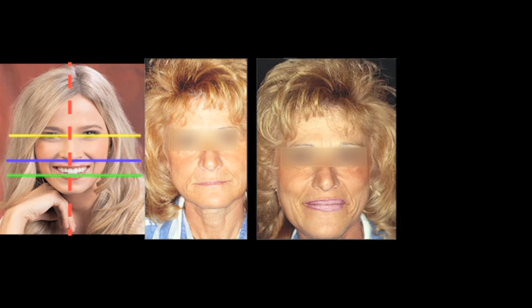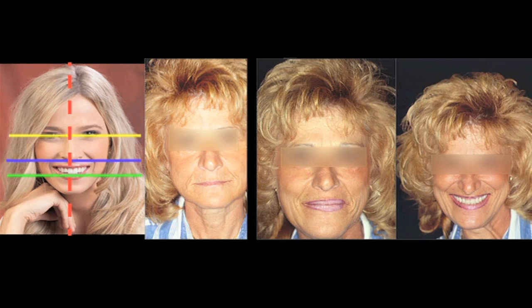So if we take that tooth position and we look at where she wanted to be using the cosmetic guidelines, and looking at where her existing denture was, and then her final with her lips together, you can notice there's a decrease in that nasolabial fold. She looks great. She has her lipstick on. And now our patient is happy. And now we have met our patient's expectation through dental implants and gave her the smile that she deserves and wants, and now she is your biggest sales point out there. Because, yes, she does have a very large social life for a wonderful, wonderful woman.